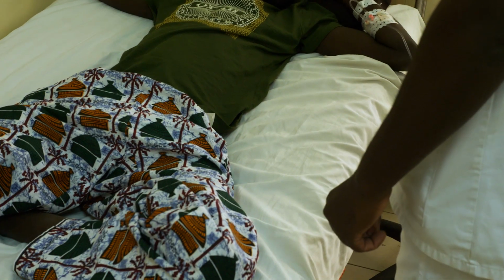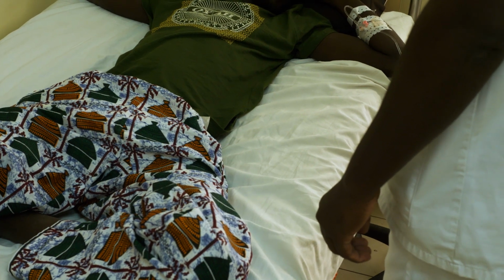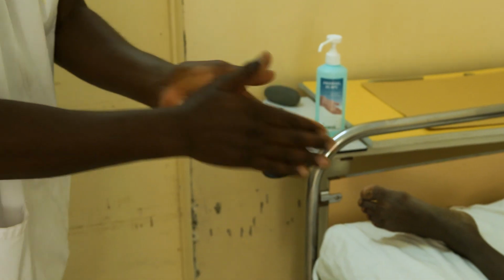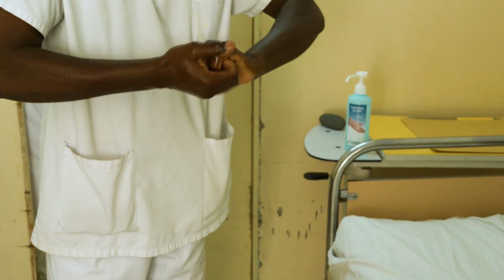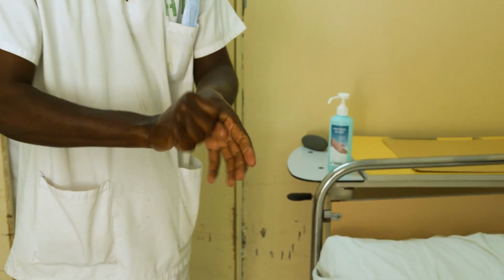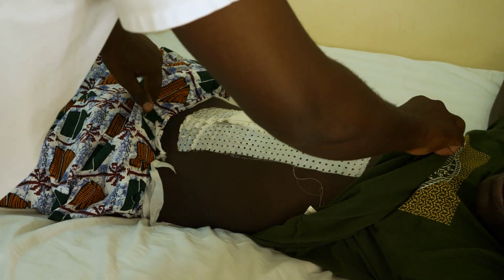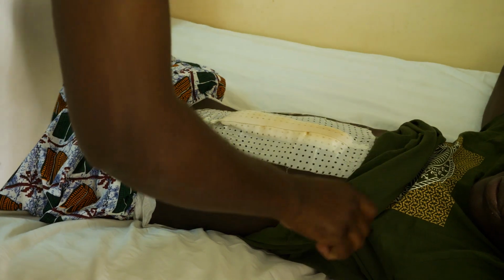Introduce yourself to the patient and explain the details of the procedure that you will be performing. Before beginning, be sure to address any concerns the patient might have. Perform hand hygiene before touching the patient. Then expose the wound dressing by adjusting the sheets and patient's clothes.